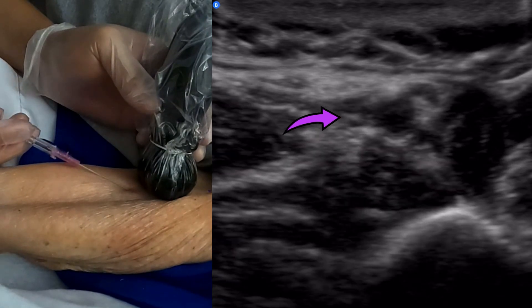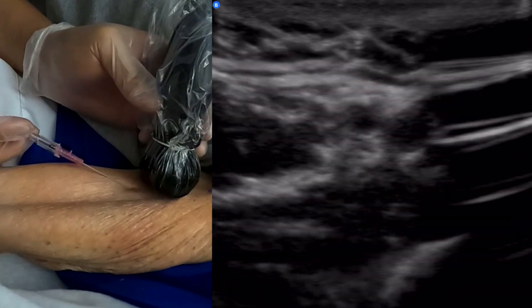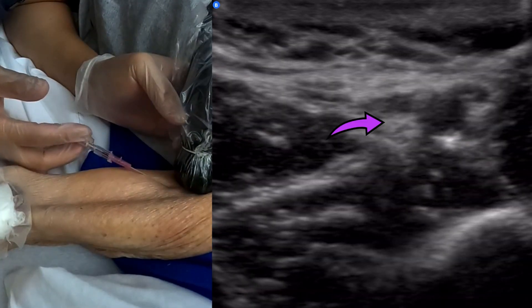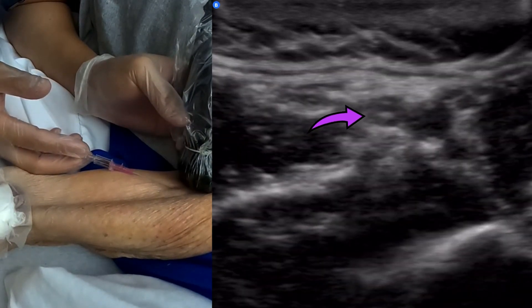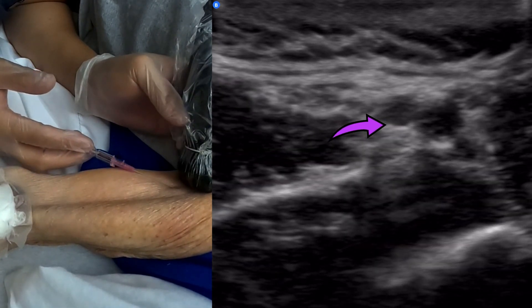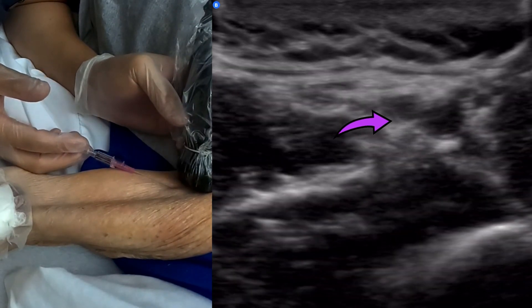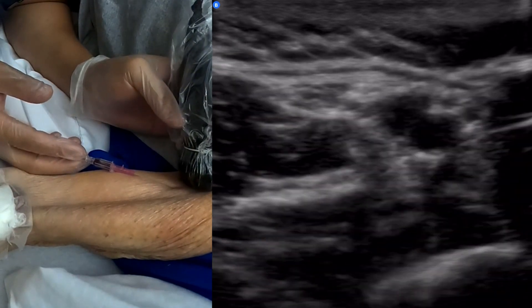There it is — there's my needle tip. I'm trying to find my needle tip again. There it is. I'm doing up, down, up, down, left, right, trying to see where I'm at. It's almost like using a joystick — if you've ever played video games. You see that snag? There's a little bit of a snag there.